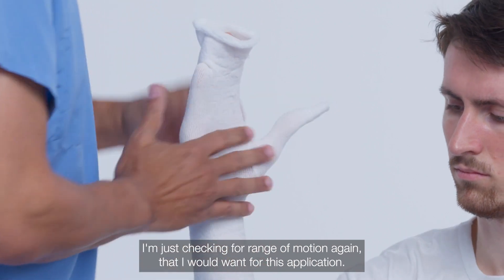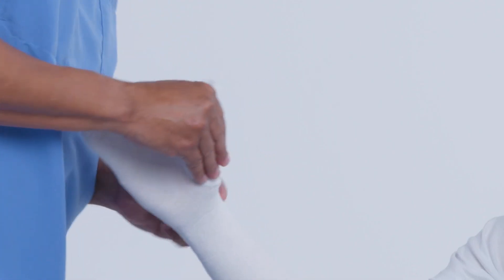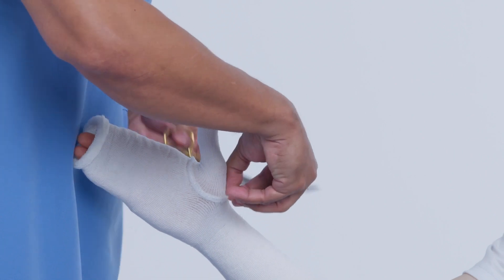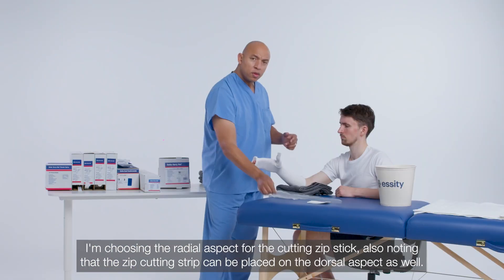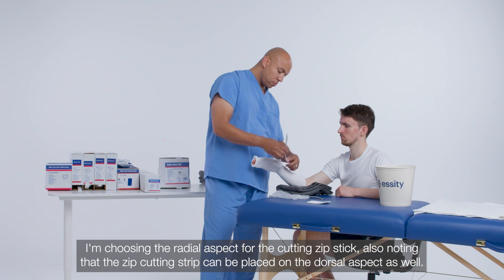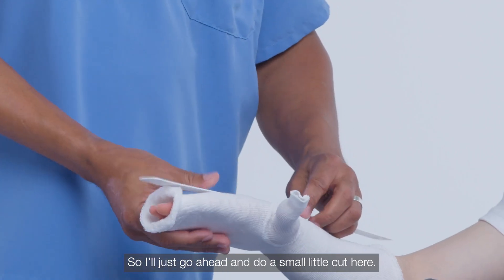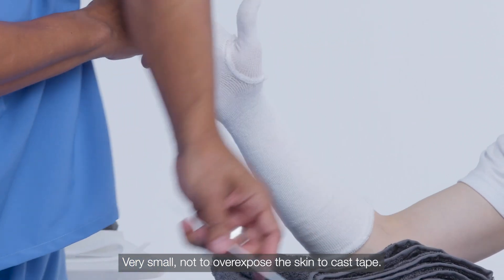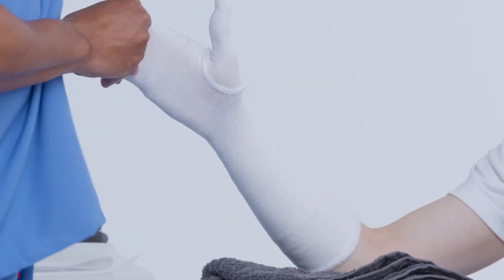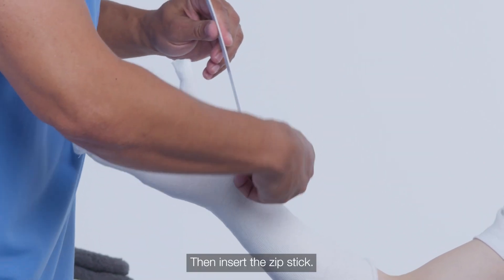I'm checking for range of motion again that I would want for this application. I'm choosing the radial aspect for the cutting zip stick, also noting that the zip cutting strip can be placed on the dorsal aspect as well. I'll do a small cut here — very small, not to overexpose the skin to cast tape — then insert the zip stick.